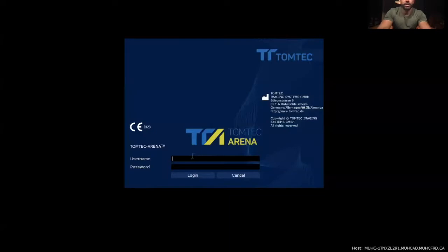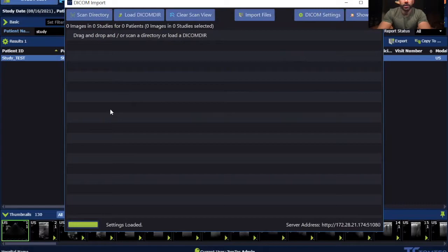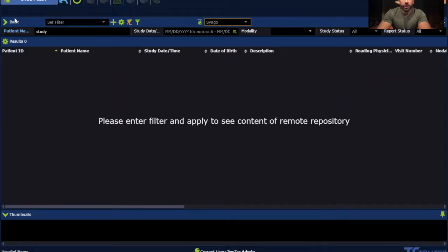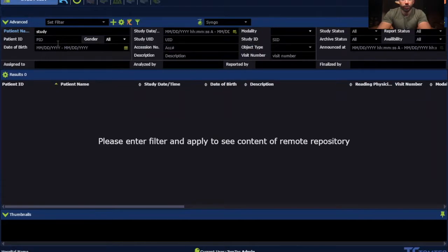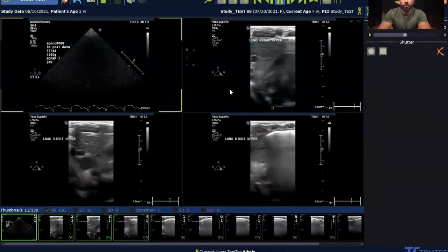I will be opening the TomTEC platform. Once we arrive on TomTEC, we have our patient selected. There are many ways of importing studies within the TomTEC platform. One is by using the import button, which lets you scan a directory of interest on a local or remote server. My TomTEC station is also associated with a PACS system, so we can use the hospital's PACS, enter the patient ID, select the patient, and import into the main platform. Here we'll be opening a participant from one of our trials.